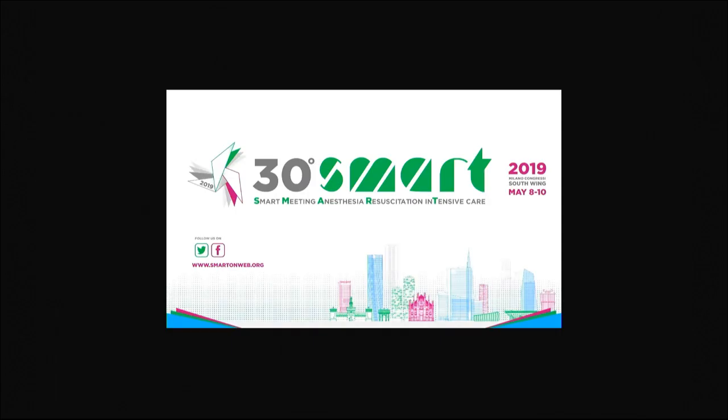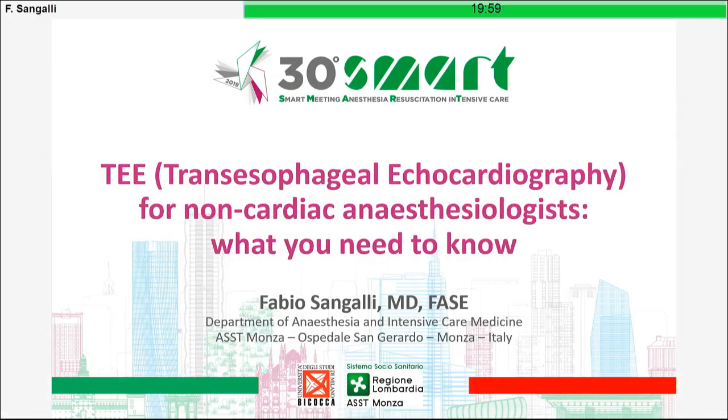Transesophageal echo. So how would you manage that, and who is going to do it in the non-cardiac setting? Well, this links us to the last presentation, I believe. I have to say, I agree with the opinion paper that says that there should be a cardiac anesthetist or a cardiologist that is familiar with LVAD, not just with echo, but echo in LVAD for these patients. So if you have complications, the first thing I would do is probably put down a probe to check exactly the interaction between the two ventricles, to be honest with you.